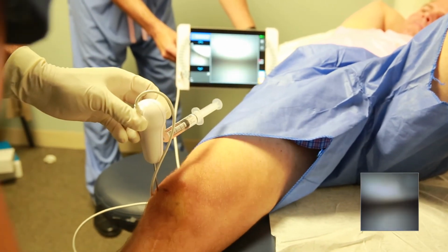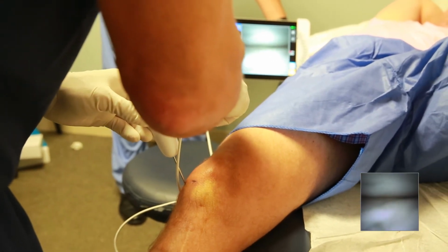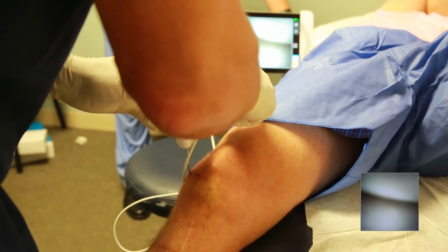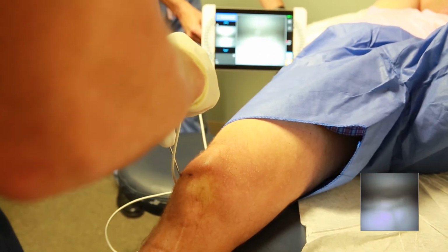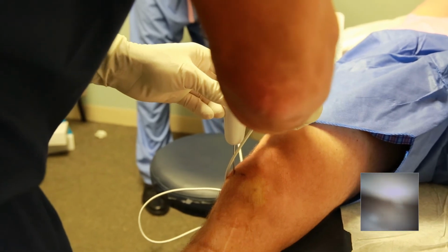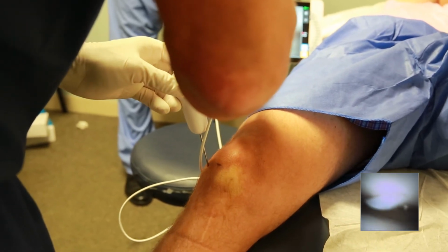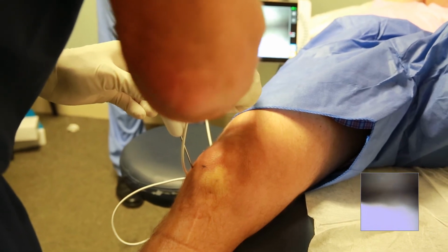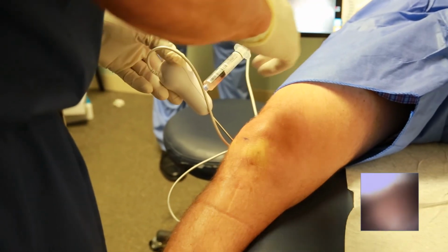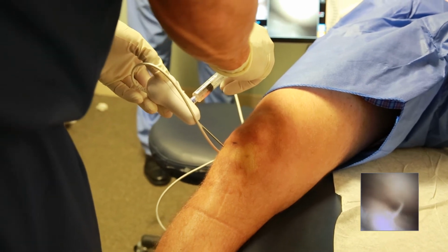Just relax your leg. There we go. And once we get in here, so we have wear, and you can see that chondrosis right there. So you got a fair amount of arthritis there, Jason, on the lateral aspect of your knee. Mm-hmm. Your meniscus is in pretty good shape in the front. Okay. And then back to your ACL, you get a really good picture of your ACL there. The ACL attachment looks good. Your medial side.